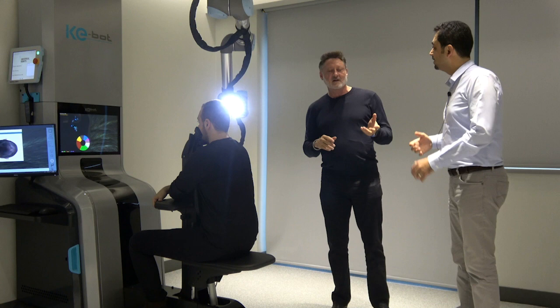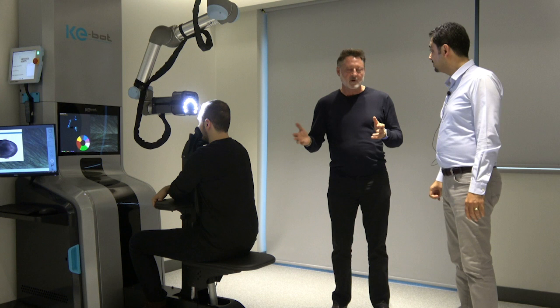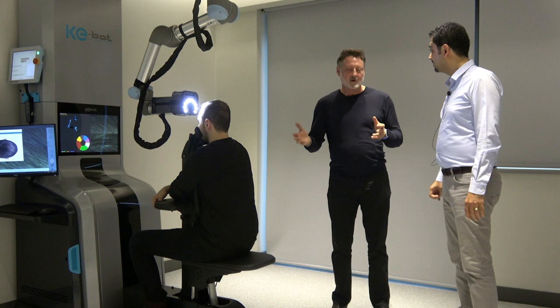You're going to calculate the wound size, and from that you can probably determine the punch size, though wound size and punch size will differ slightly because of the angle. It's an amazing piece of equipment — I know I want one. Congratulations, and I'm proud of you.